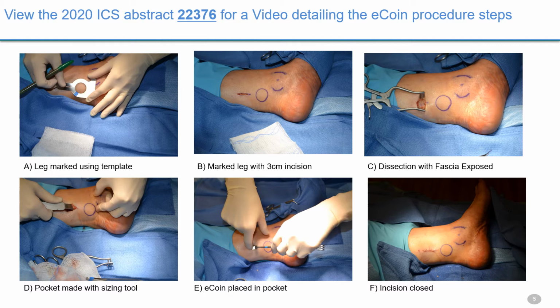For my 26 implants, none required cautery, narcotics, or IV antibiotics. There is no need for a C-arm or ultrasound, nor interrogation of the device. Although placement is more specific compared to sacral neuromodulation IPG surgery, the procedure has a short learning curve and should allow for an efficient workflow. Anticipate standardized kits similar to a central line with commercialization.